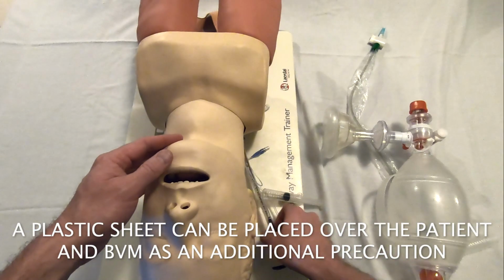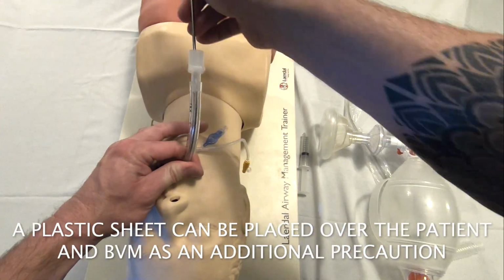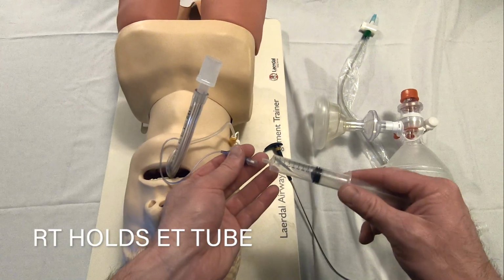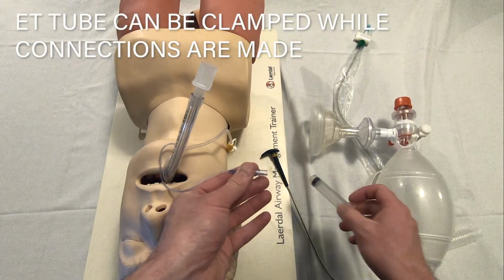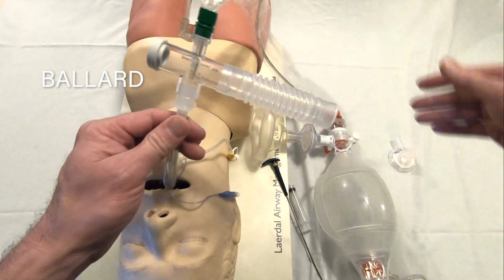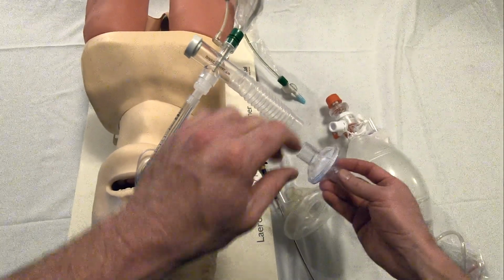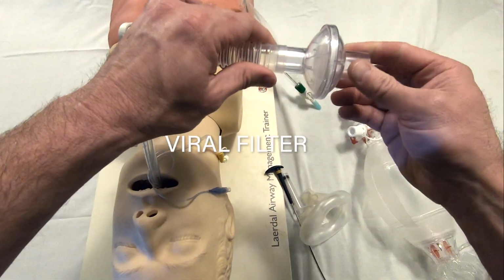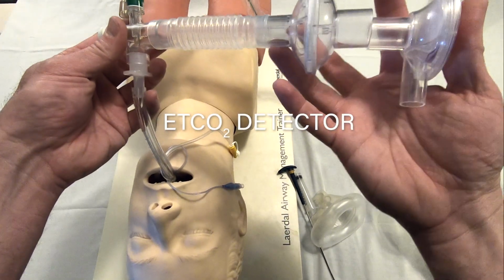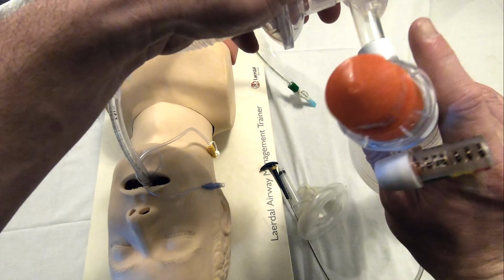The ET tube should be passed as quickly as possible, and ideally just as the patient becomes apneic, so that we don't have to bag while we're manually trying to maintain a good seal. The ET tube cuff should immediately be inflated. Next, the ballard is attached, followed by the viral filter, end-tidal CO2 detector, and then the bag.